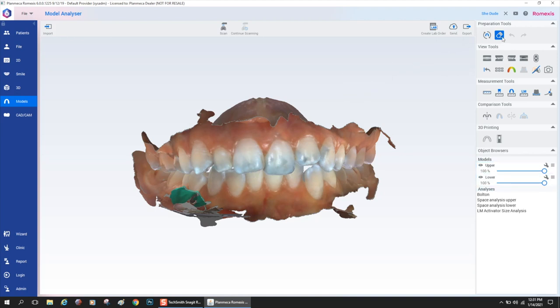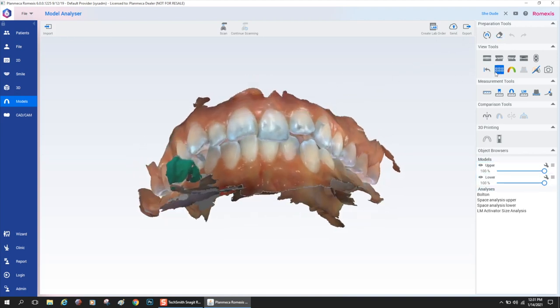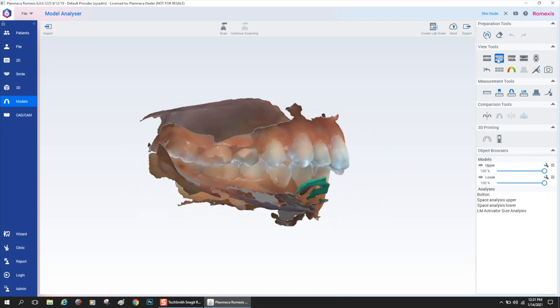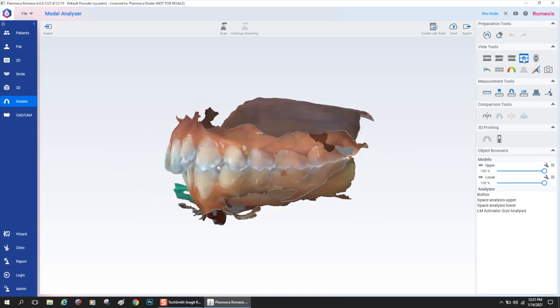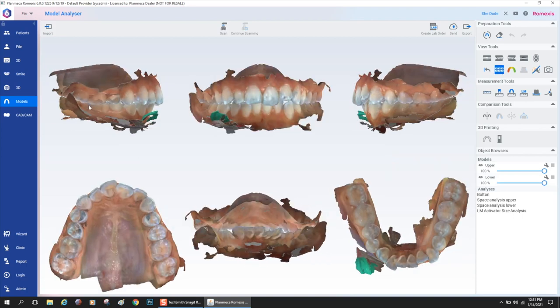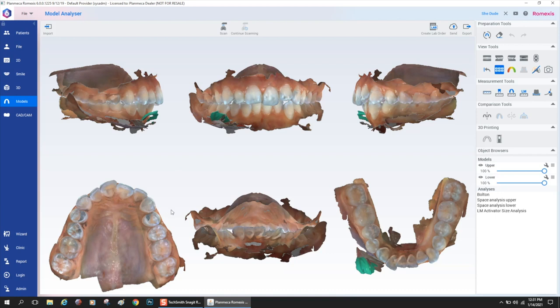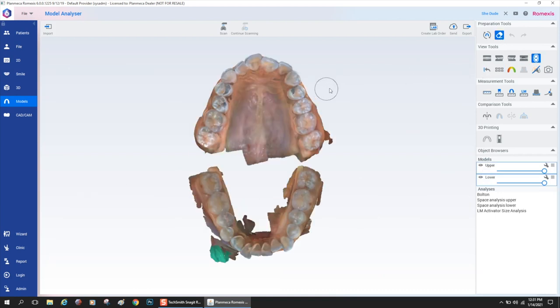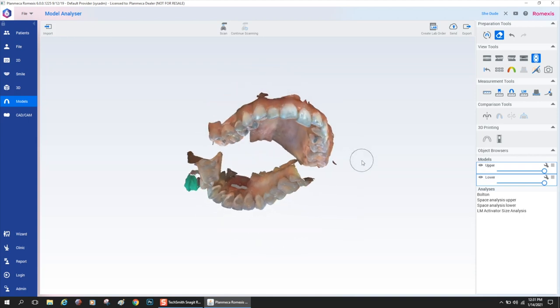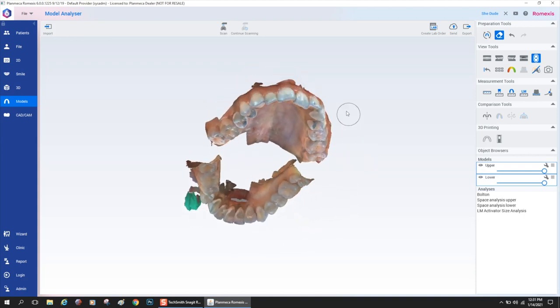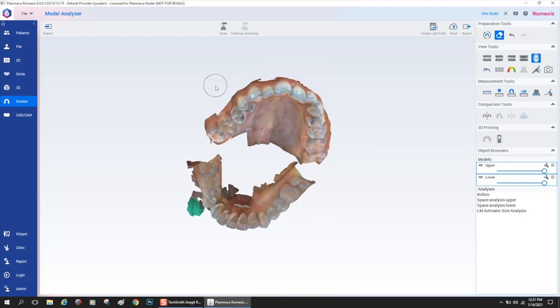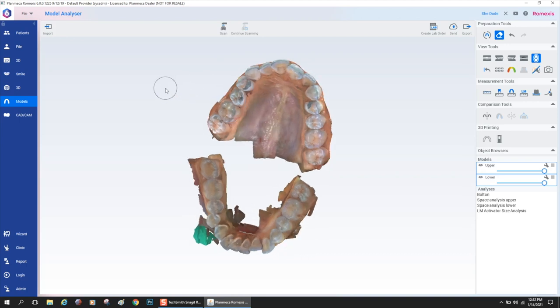One thing you could do is erase extraneous data from the intraoral scan. Sometimes when you scan, if you don't erase it natively in the scan tab, which is probably the best way to do it, you could erase it here. Also, you could look at the model on all these cool views. By clicking the photo deck, you could get these six views that orthodontists often take photos in. It might eliminate the need to make intraoral photos if you have the ability to get really nice color scans and then set them all up in the appropriate orientations instantly.